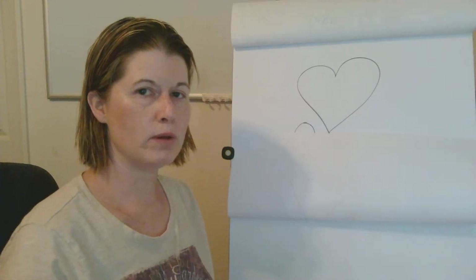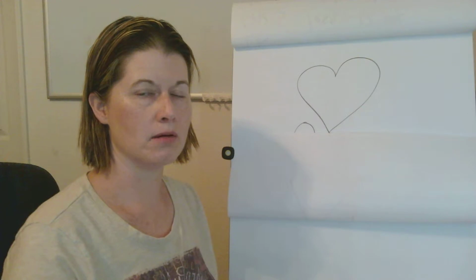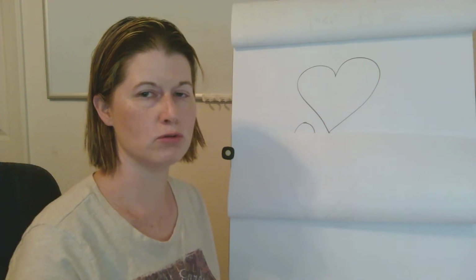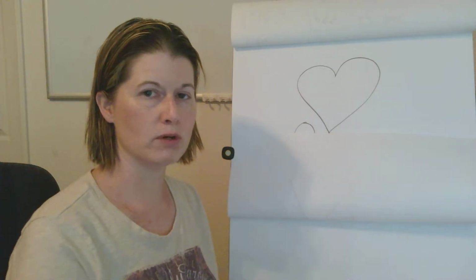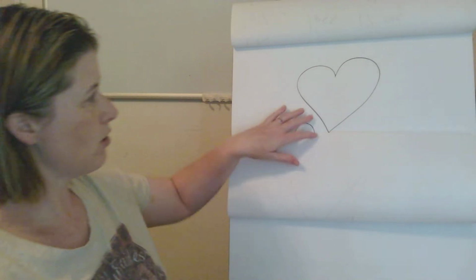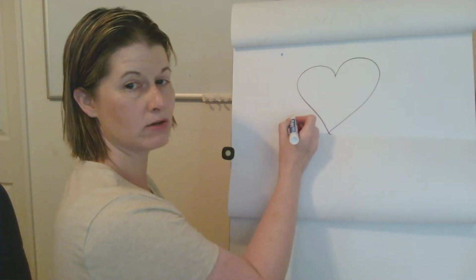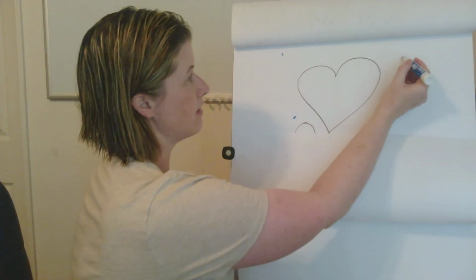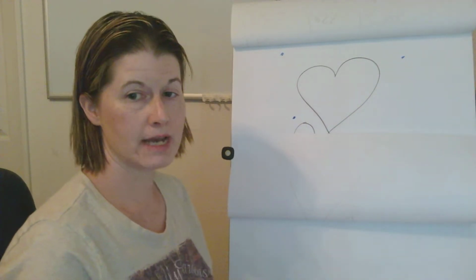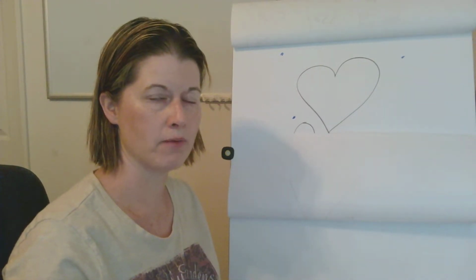That being said, we put the EKG leads on, which is what I'm going to talk about first, and we're really just taking multiple images, multiple shots, multiple angles of the heart in order to gather information. And through research and evidence, we know that certain patterns mean certain things. Okay? So if you have the heart and then you have your leads, you have to have at least 3 leads. And we're not going to get real technical. Remember, I want to make it simple. If you have these 3 leads around the heart, picture this analogy. This is my best analogy, especially when you get into 12-lead EKGs, which we're not going to do right now.